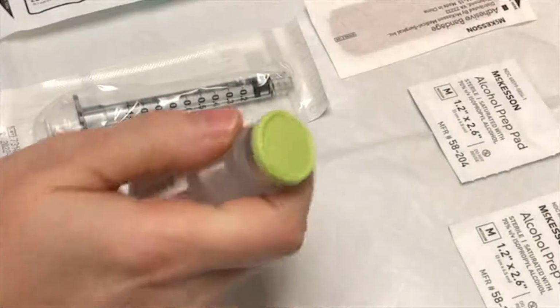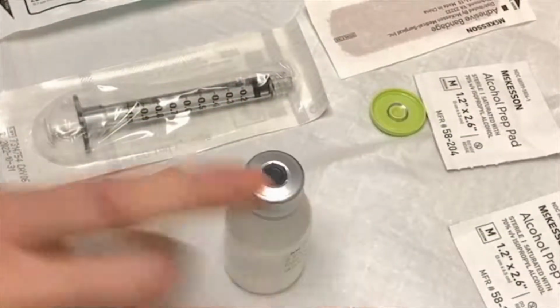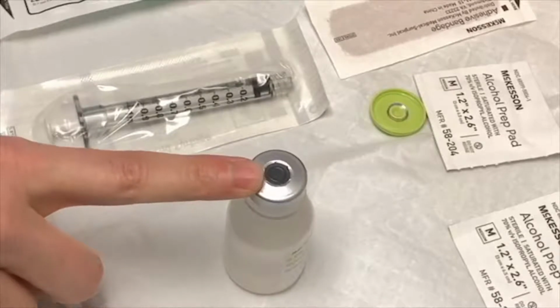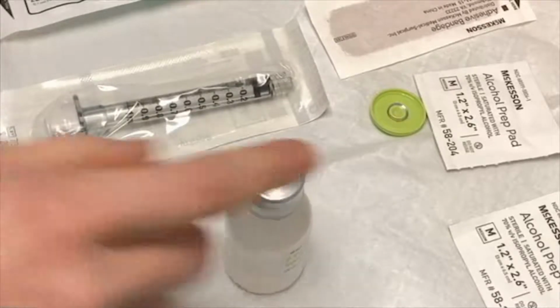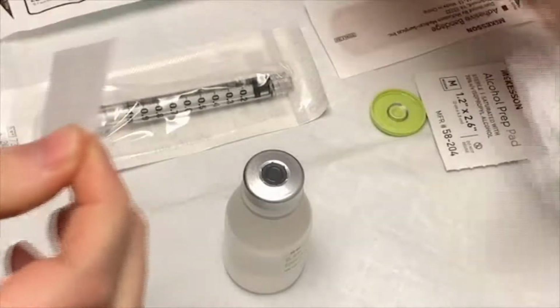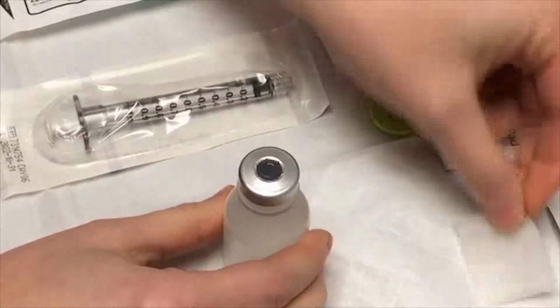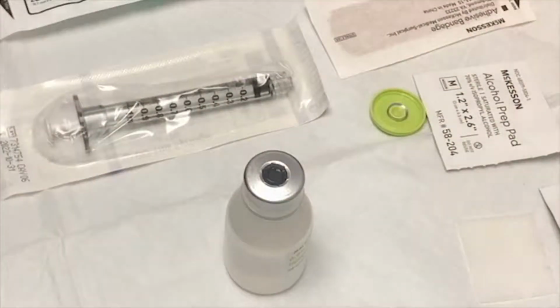First, pop the top off of your vial. Once that goes off, it does not go back on. The rubber stopper in the center of your vial keeps your medication from spilling out. Before each use, you always want to clean the top of your vial off with an alcohol prep pad. So with a single wipe, clean off the rubber stopper and allow it to air dry. Do not wipe off the vial with anything else.